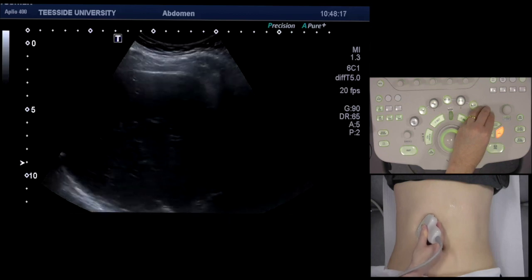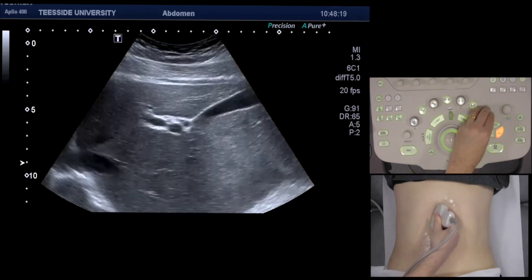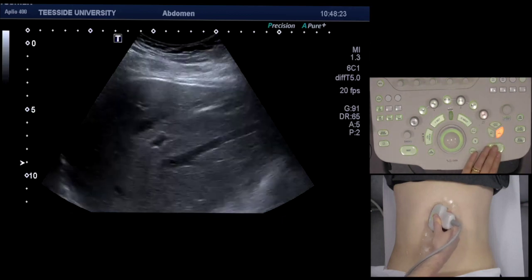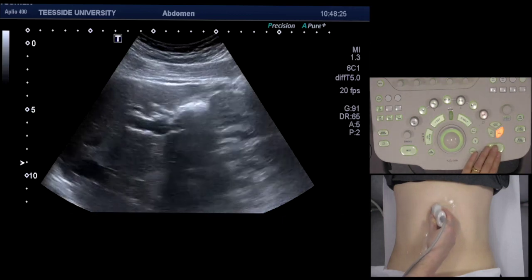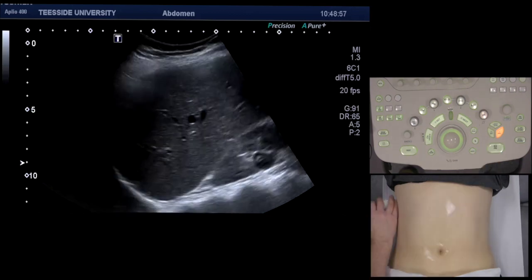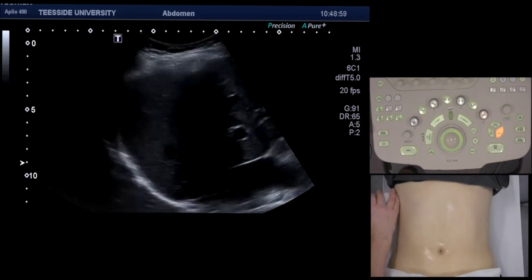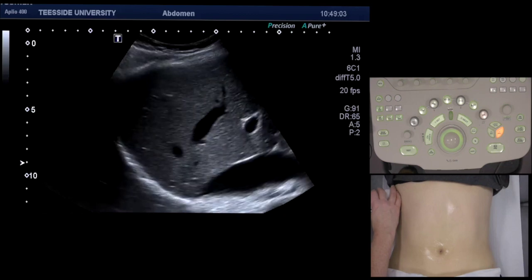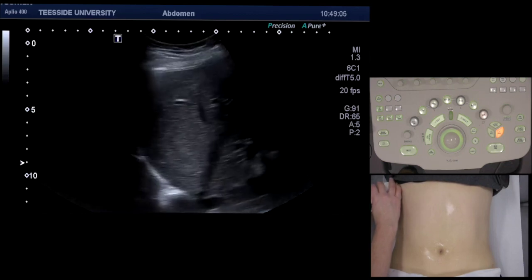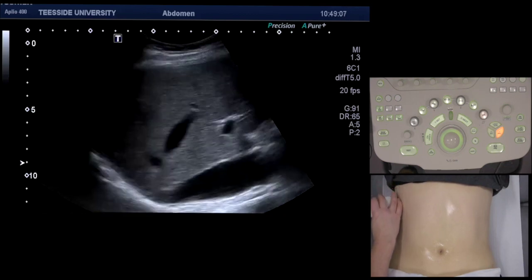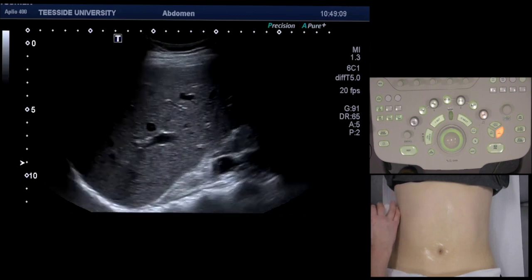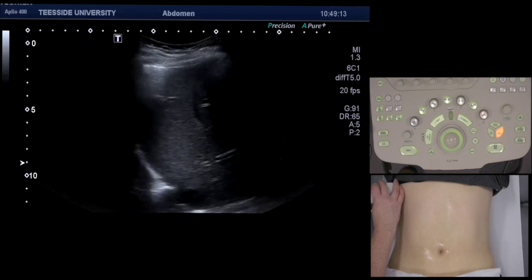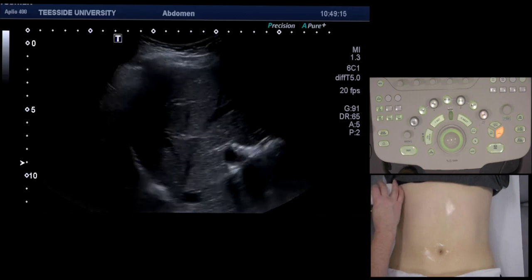Whenever I'm looking at the gallbladder, I also always look at the liver, sweeping through it and looking for any intrahepatic duct dilatation, which is very important. As you can see, I'm just sweeping through in long section. If somebody is very gassy, what you can also do is scan intercostally like this, moving up and down the rib spaces and changing respiration.